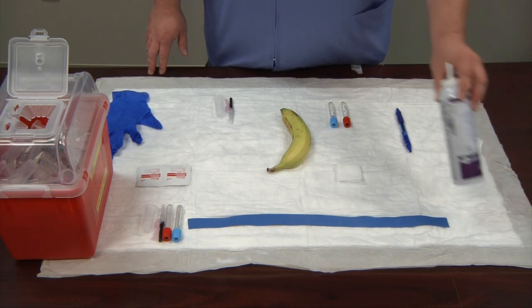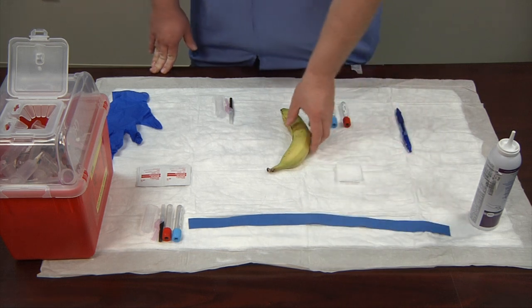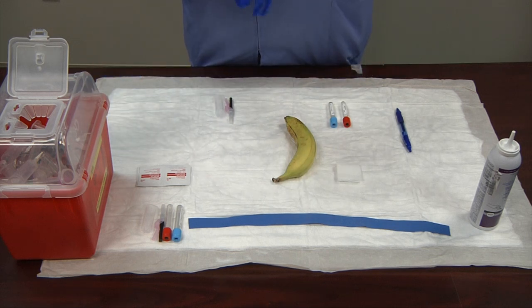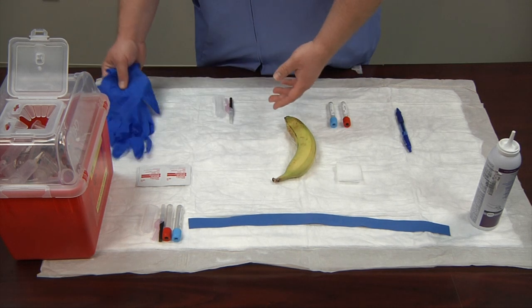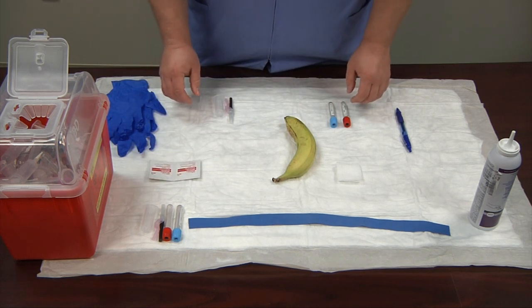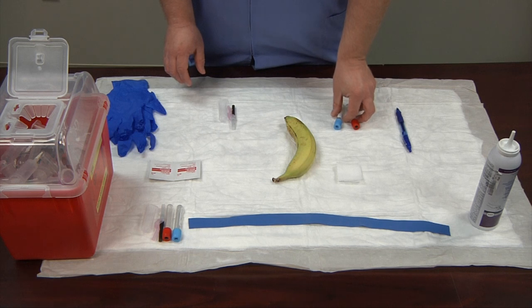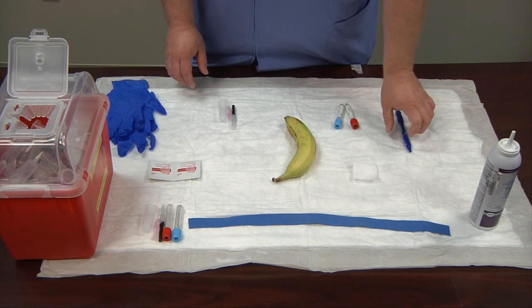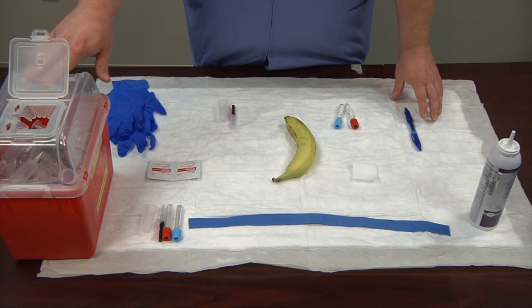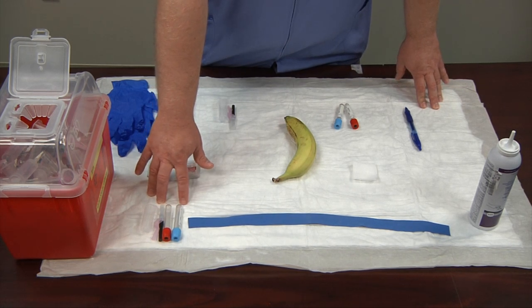The supplies you'll need for a banana blood draw are: hand sanitizer, your tourniquet, your banana (preferably a green one), your PPE — in this case gloves — alcohol swabs with 70% isopropyl alcohol, your vacutainer needle and tubes, 2x2 gauze, and a pen to label with when done. Have your biohazard box nearby within arm's reach, and keep an extra needle and extra set of tubes in case of complications or loss of suction.